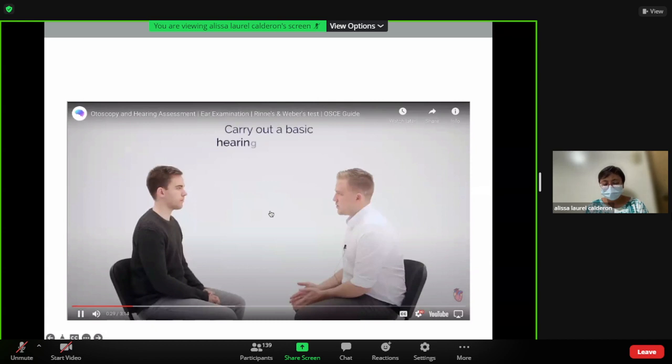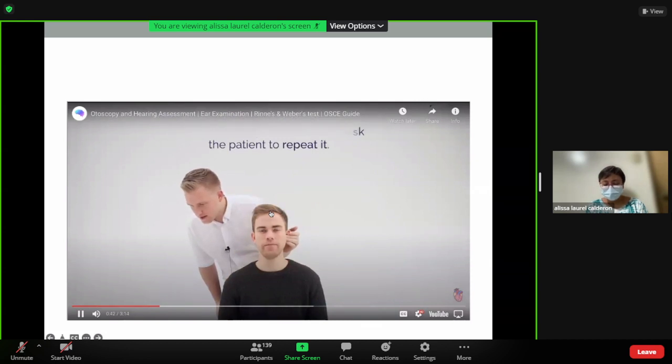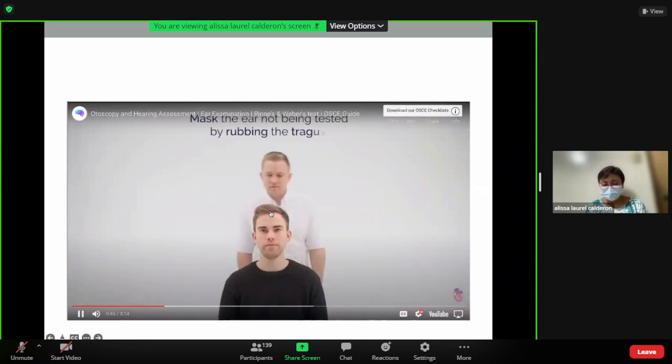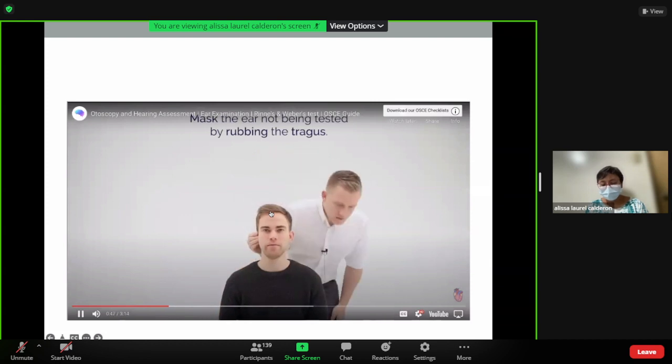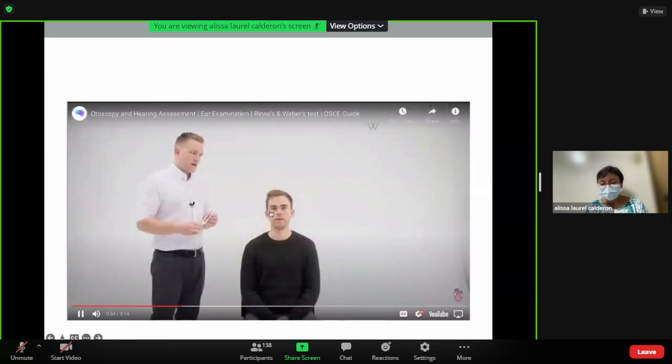Okay. James, I'm now going to start with a simple hearing test. I'm going to stand behind you, and I'm going to speak three different numbers into each ear. I want you to repeat them back to me when you hear them. 66. 66. 43. 43. 71. 71. 66. 60. 41. 41. 23. 23. I'm now going to place this tuning fork in the middle of your forehead. Let me know whether you hear it loudest in one ear or the other or the middle.